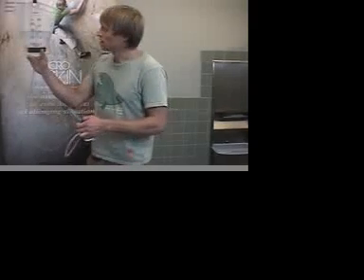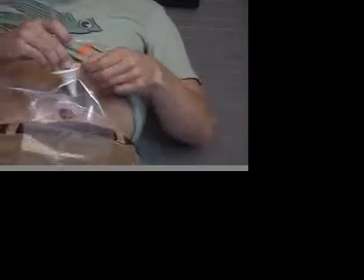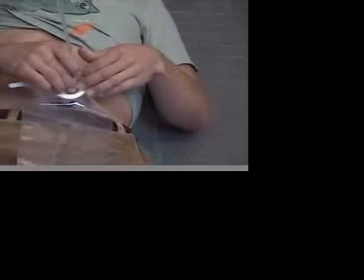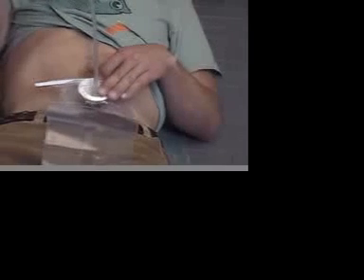And I've got my water here. I'll lie down. I simply place the cone of the irrigation into the stoma gently. It should be relaxed for the water to go in. If you feel tightness, you've got to wait and relax. And I'll start to apply the water.